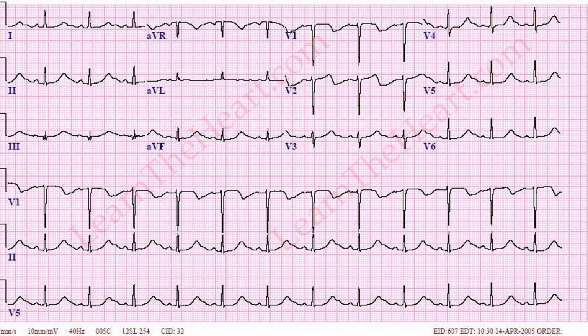So let's take a look at this 12-lead EKG. The EKG machine quite often will report the QTc interval, but there is one quick way to eyeball it for yourself. The normal QT interval should be roughly less than 50% of the RR interval. And again, if it seems that it's more than 50%, then it's likely to be prolonged, like in this case.